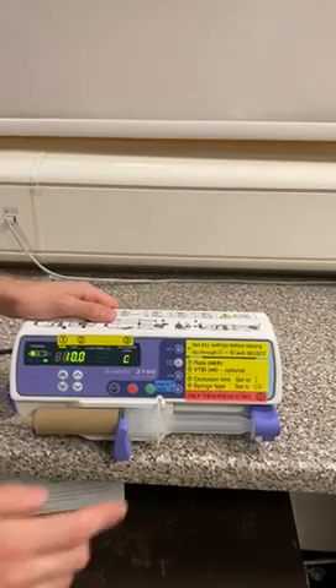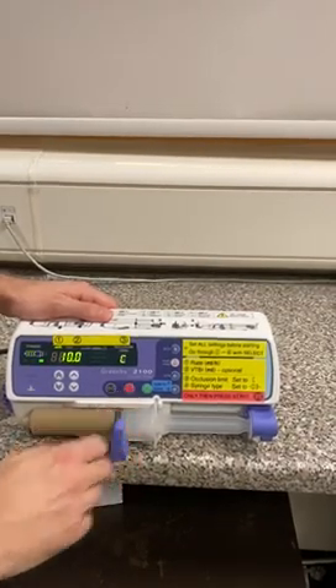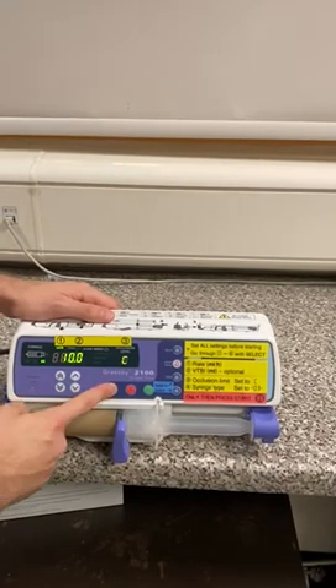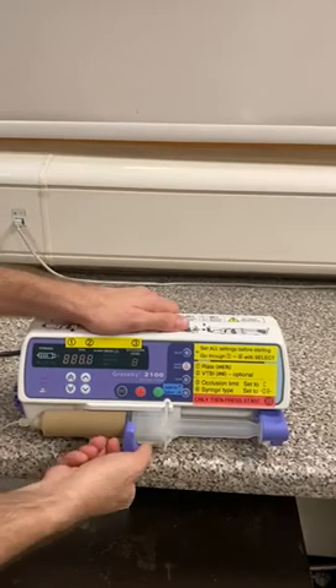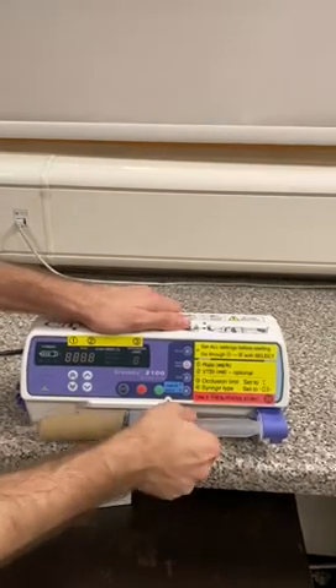Finally, when we want to finish, we need to press the red button to stop and hold the on-off button again until the pump turns off. Then to unload the syringe, it's the reverse of what we did before: we open the clamp and remove the syringe.